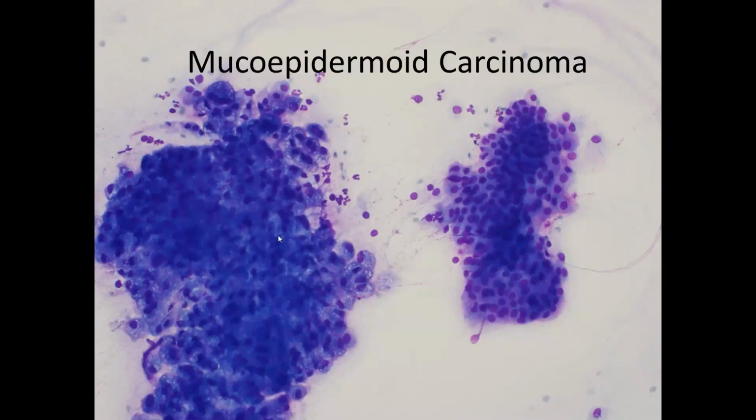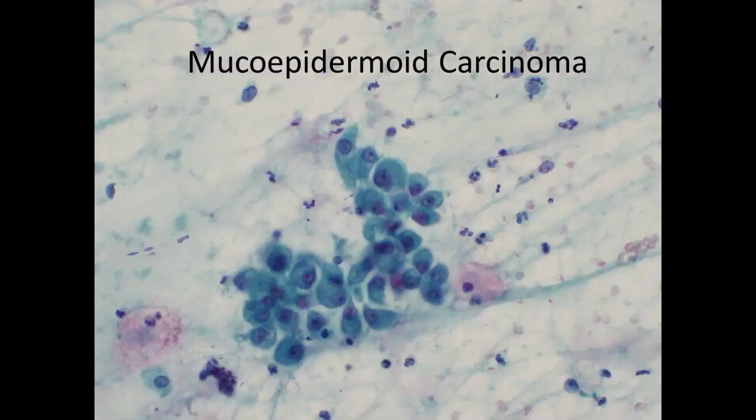So the key to the diagnosis is recognizing the mucinous background, identifying the nondescript squamoid cells, and then finding a population of the mucin-producing histiocyte-like cells, the goblet cells. Sometimes they'll be abundant, as in this example, but a lot of times you'll have a cluster of the epidermoid squamoid cells with dense angulated cytoplasm, and punctuating these groups, you'll just have the goblet cells, the histiocyte-like cells, which are usually easier to recognize in the pap. The mucin will be highlighted pink. And so it can be hard to tell these from mucophages.